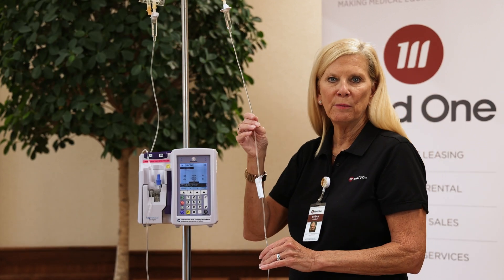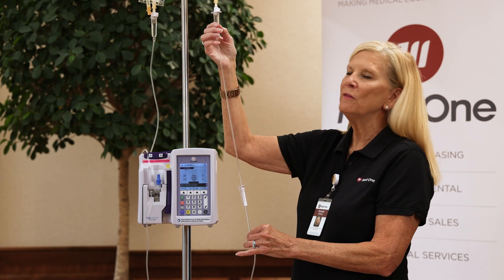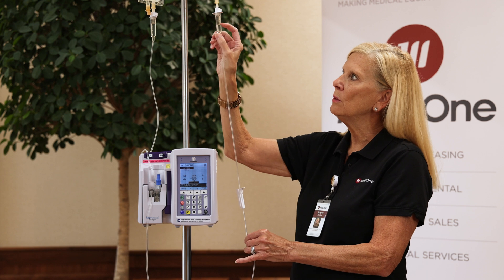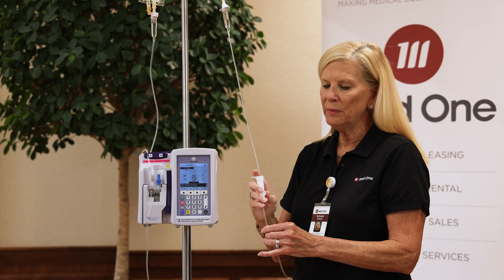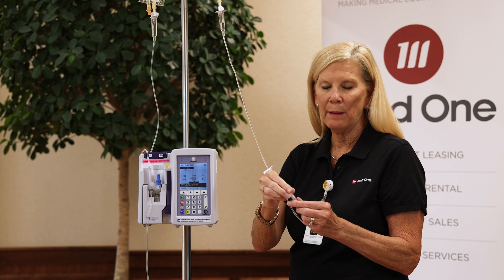Just like you squeezed on the drip chamber for the primary line, there is a notch on the secondary tubing for the piggyback. You'll squeeze it until you reach that notch. Then you simply open up the roller clamp and prime until you hit the end with this protected cap.